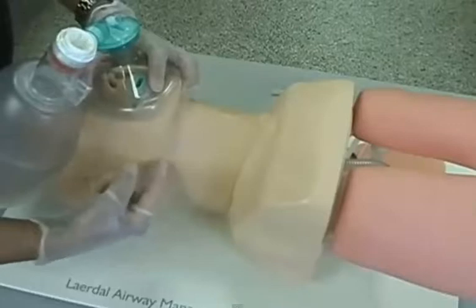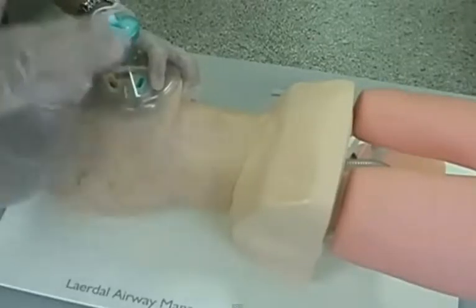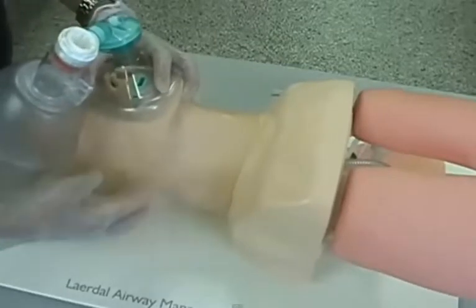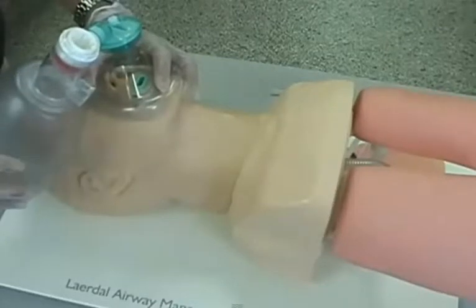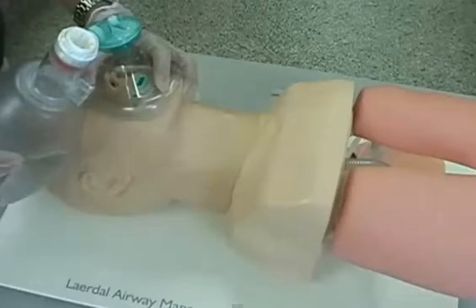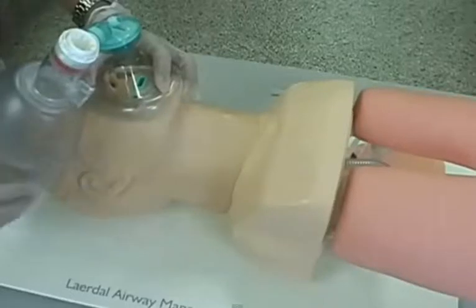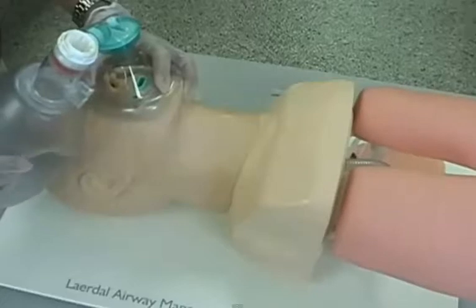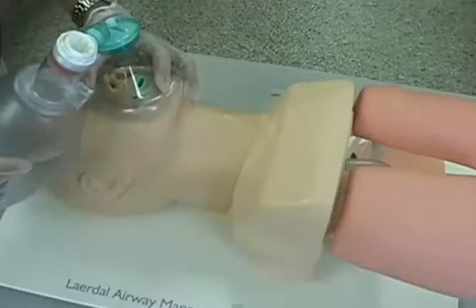So you always want to visualize and mentally know that you're pulling the jaw upwards, not forcing the mask down. If we just push the mask straight down, we'll occlude the airway just positionally. So we want to pull the jaw upwards to the mask and then gently ventilate nice and slowly over a period of at least a second, just enough to see chest rise and fall. And you're always checking to make sure that you're not losing air around the mask. But chest rise and fall is the best indicator that we're moving adequate tidal volumes.